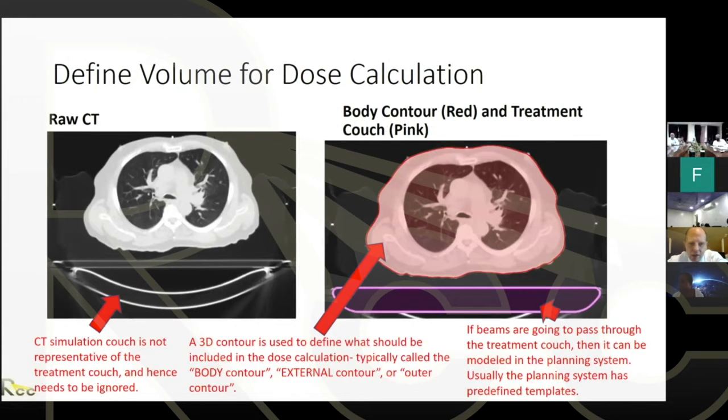As far as using MRI goes, that's another good question. CT is very useful because the Hounsfield unit is related to attenuation, which has a very direct relationship with electron density, which is what we need for dose calculation. There are studies, and in certain cases, we can use MRI for the dose calculation. But the trick there is that the relationship between the intensity and the electron density is not straightforward. And so usually you have to identify what the organs are and then assign a density to those. And so that just adds a level of uncertainty for the dose calculation.